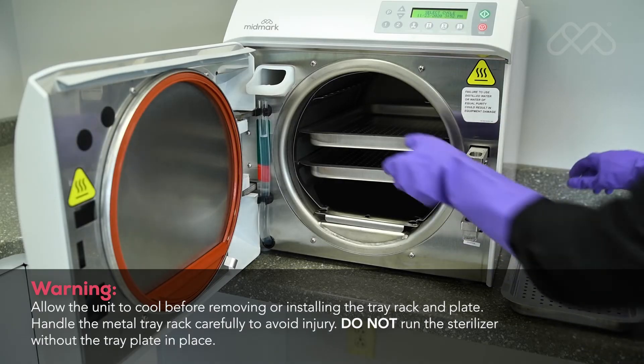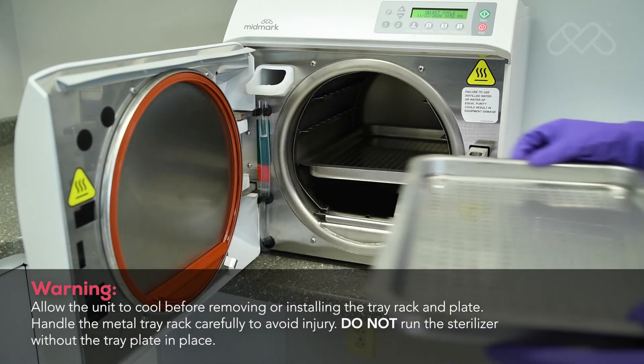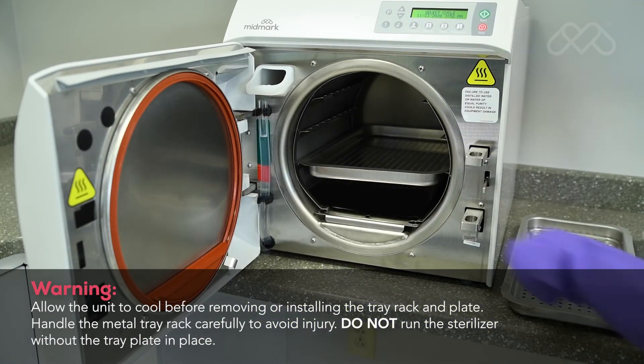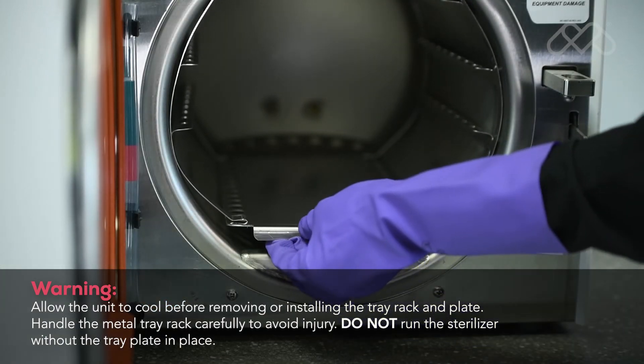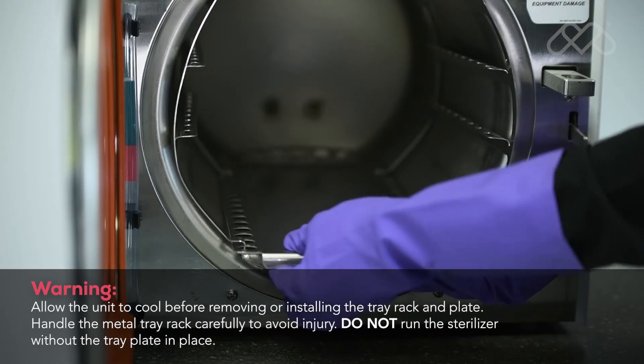Remove the trays, tray rack, and tray plate from the sterilizer. To remove the tray rack and plate, you must first remove the trays. Using a screwdriver, pry the plate up while pulling the tray rack and plate out of the chamber.